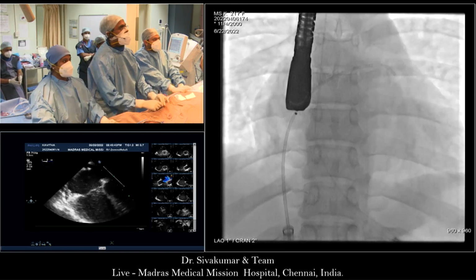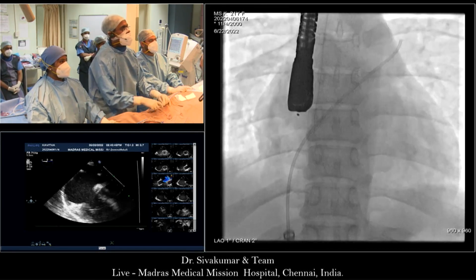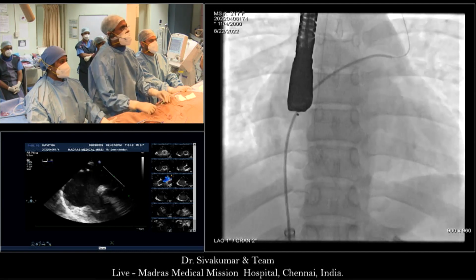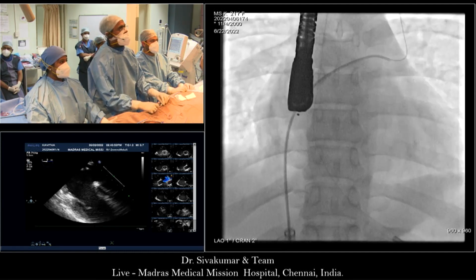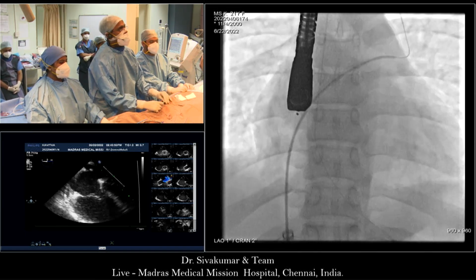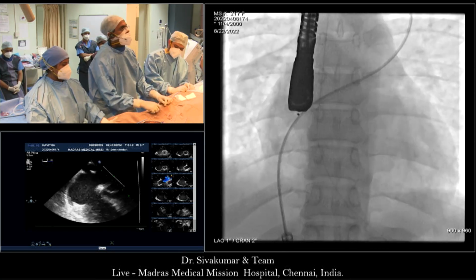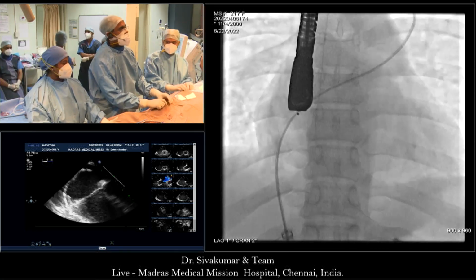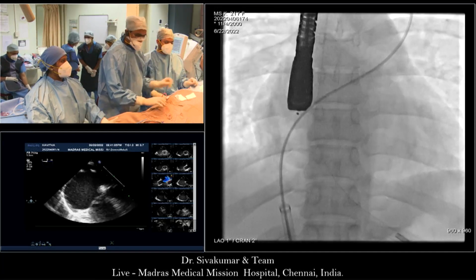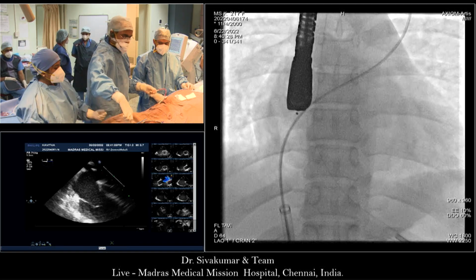Thank you. Thank you, okay, very much. We'll try. I just want to clarify, whenever you have thin posterior rims, like you were saying, the device will always touch there. Whenever you have a thin IVC rim, always thin, the disc will always be closer. That doesn't mean the device is not oversized. Oversized depends on when you look at the aorta. When you look at the aorta and the waist is touching, and every time the heart distally in the aorta expands and you see the device opening up, that's oversized. And that device is clearly oversized.